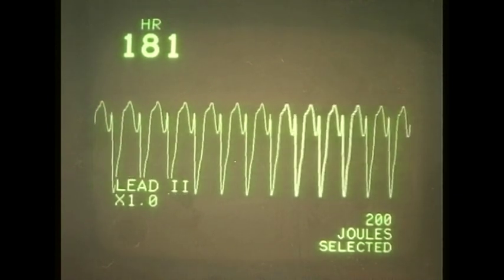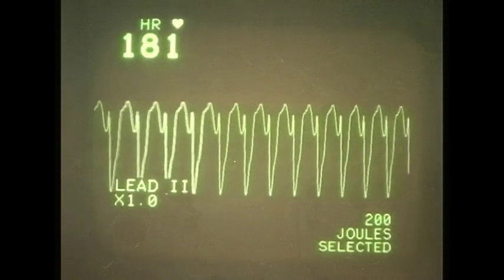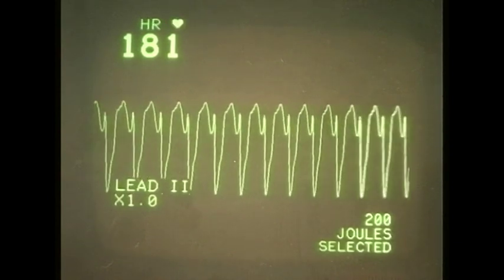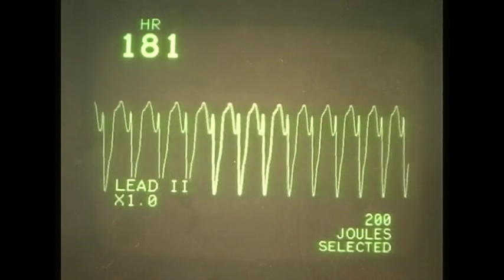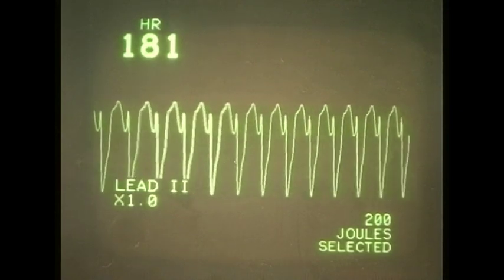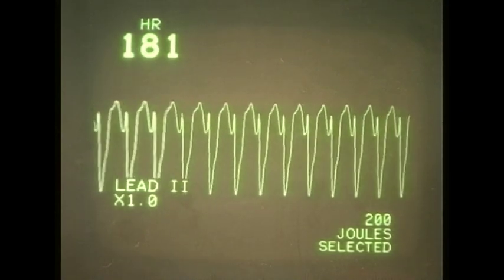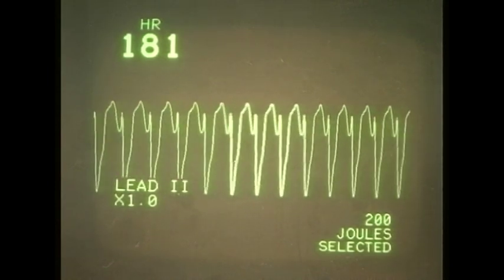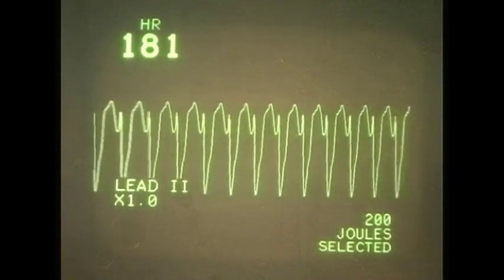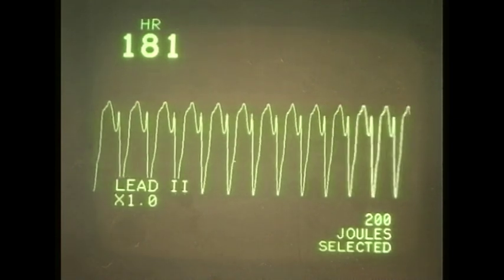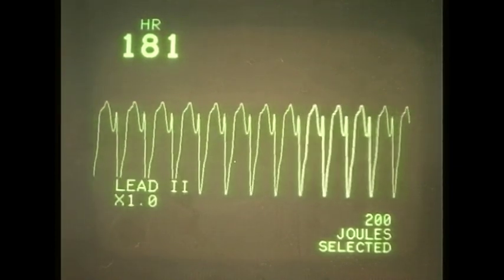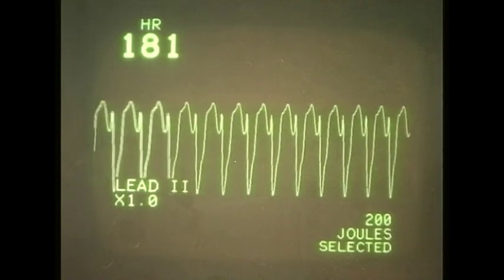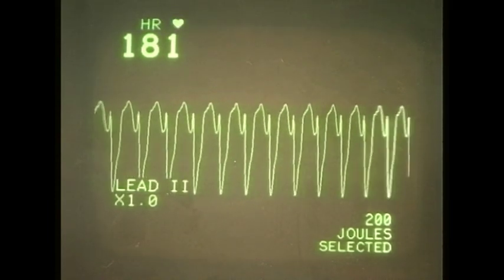People may well still have a blood pressure with this and be conscious. They must feel pretty bad. They feel quite ill, very hypotensive. And in that case we need expert help and usually cardioversion of the rhythm. So ideally you would give them some sort of anaesthetic and then defibrillate them following that. If they were pulseless and unconscious, then again it just needs prompt defibrillation. I've heard these complexes described as WEB complexes, wide, early, bizarre. And this would be the normal sort of rate for ventricular tachycardia? We would see a fast rate. Anything over 120 beats per minute we would count as a ventricular tachycardia. And any more than three complexes together.